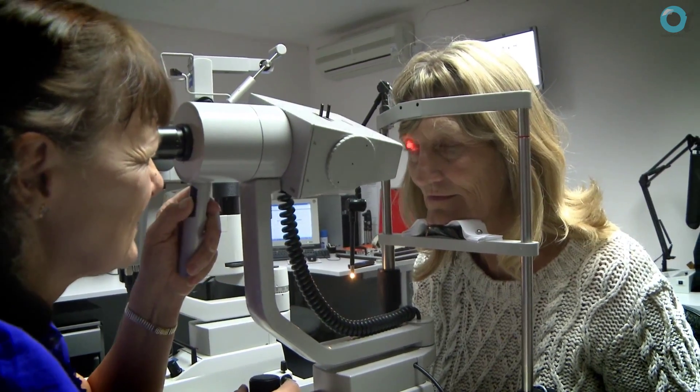You use a stopwatch, get the patient to blink once and stare as long as they can, and then when the mires distort, you stop. So what you actually do is get the keratometer mires in focus, get the patient to blink once, start your stopwatch, and when the mires — the circles — degrade, you know the tear film is breaking up. You stop the stopwatch and you've got your break-up time.